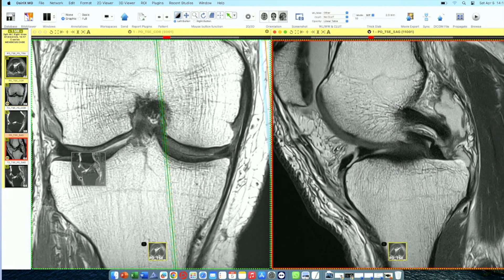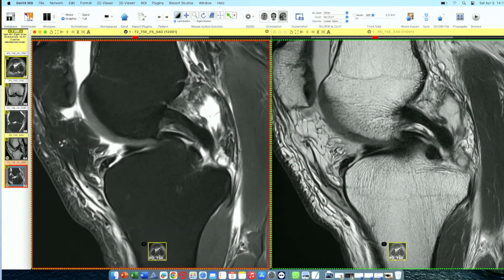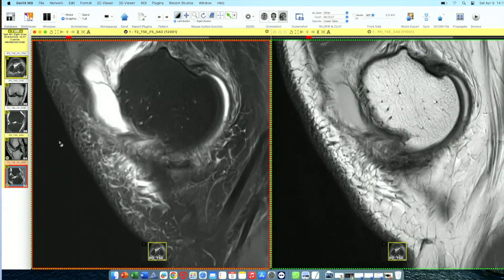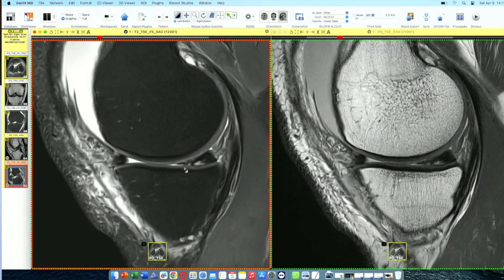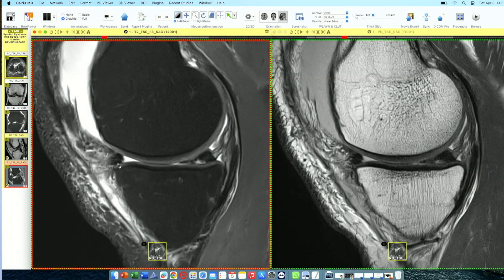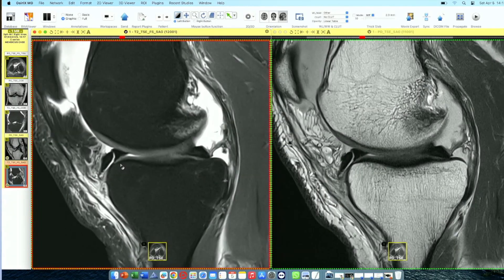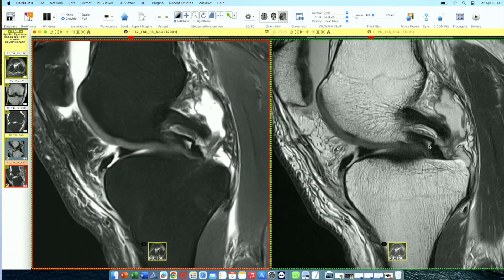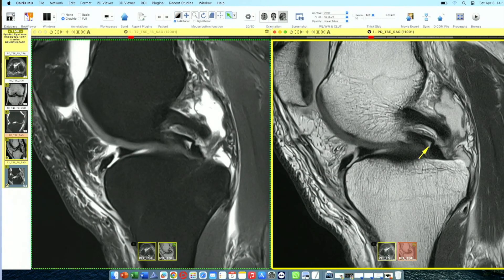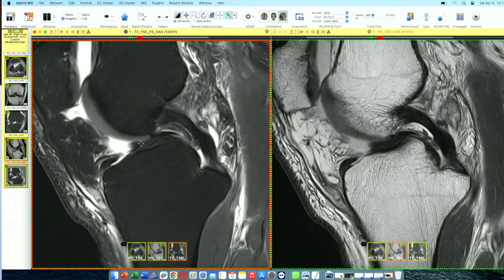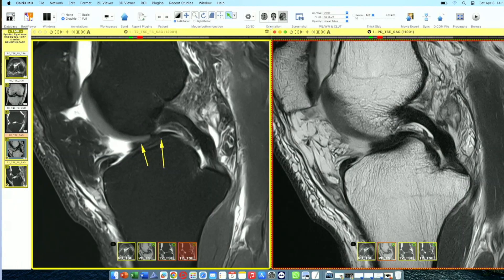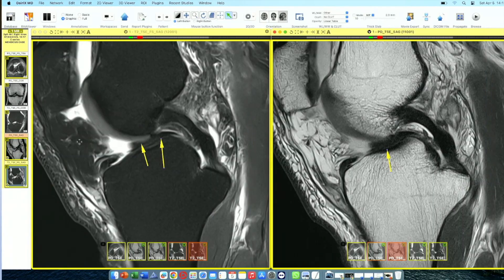Moving to Case 2 — again a medial meniscus pathology. Going from periphery to midline, there is a horizontal signal going to the inferior surface and the inferior part of the posterior horn is not properly visible. Additionally, the anterior horn is blunted. Going further toward the midline, you can appreciate the double PCL sign — this is your PCL and this is the meniscal flap just anterior to it. Further in the midline, the meniscal flap is in the intercondylar notch.